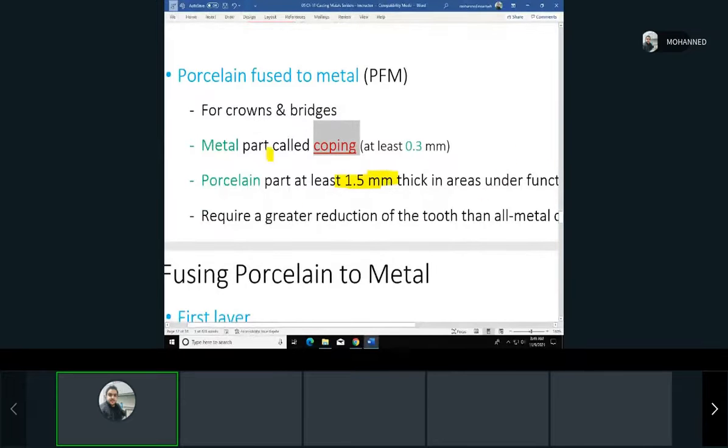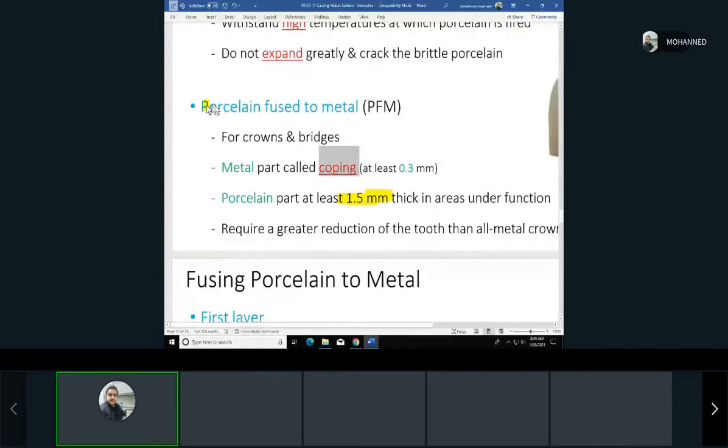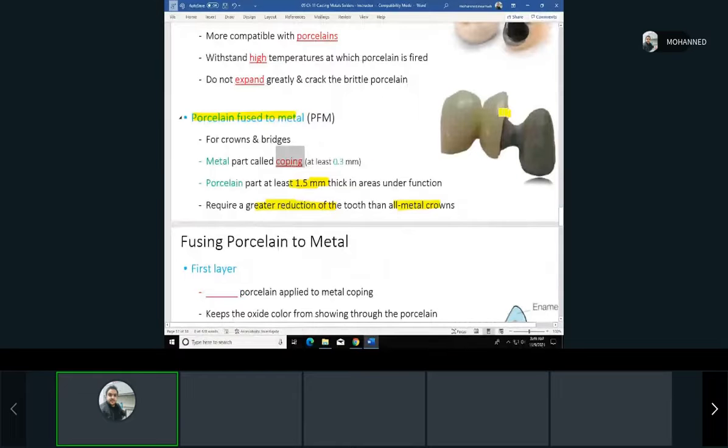in the functional areas. So if you compare a porcelain fused to metal crown to an all metal crown, with porcelain fused to metal we need to reduce the tooth more to allow that thickness of the porcelain. Make sense? Because you need all of that thickness. See how much thickness we need here? So we need a lot more reduction compared to just a metal one, just like we saw in the video. The metal one would require much less, maybe about 0.5 millimeters only of thickness. So you don't have to drill the tooth too much to make space for the crown, because again, the metal would withstand much more occlusal loads with less thickness. Make sense?